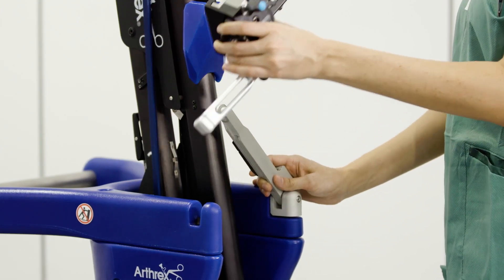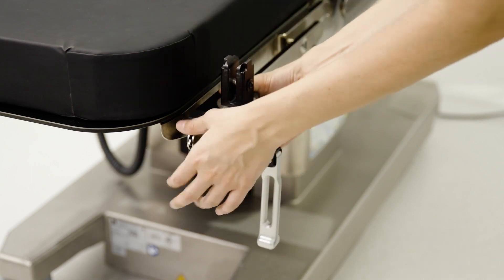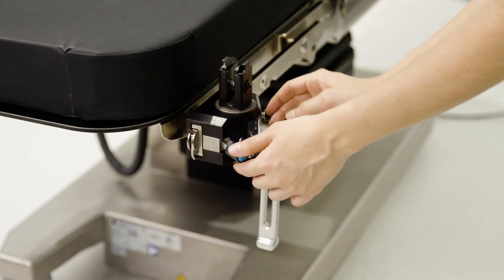Attach the tower to the OR bed by sliding on the rail clamp and secure it at the rail end by tightening both knobs.